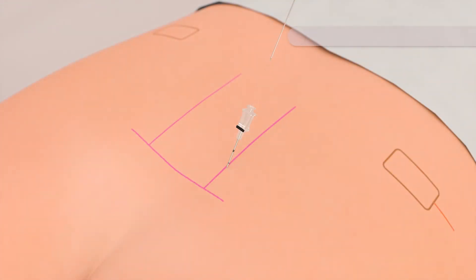Once ideal response is achieved, the stylet is removed from the needle and the directional guide is advanced to the indicated mark depending on the length of needle being used. The foramen needle is removed over the directional guide. A small half centimeter incision is made at the insertion point to accommodate the lead introducer.